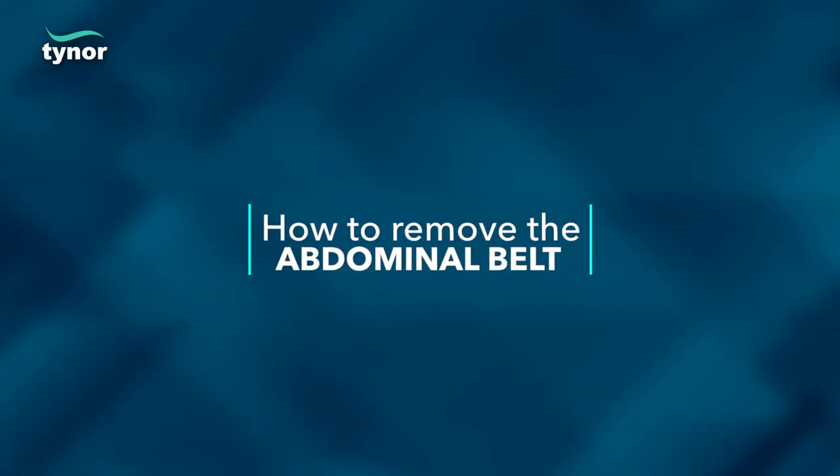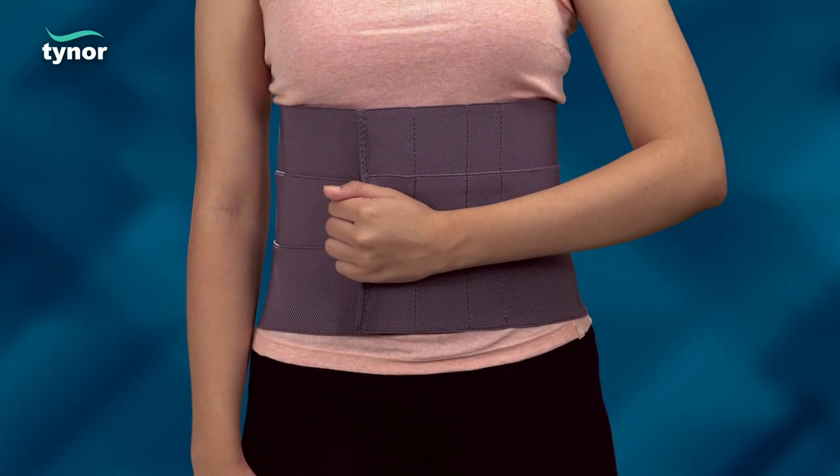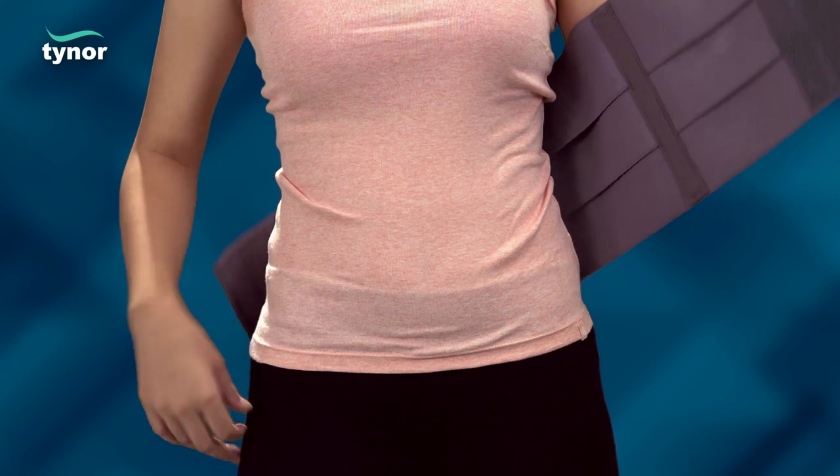Now let us see how to remove the abdominal belt. The product can be easily removed by unfastening the velcro straps.